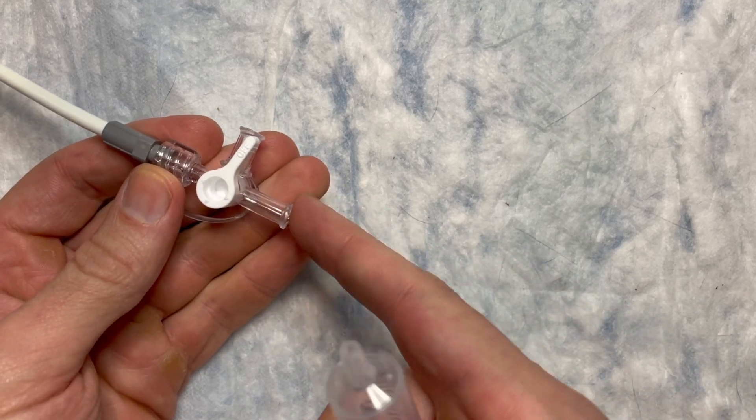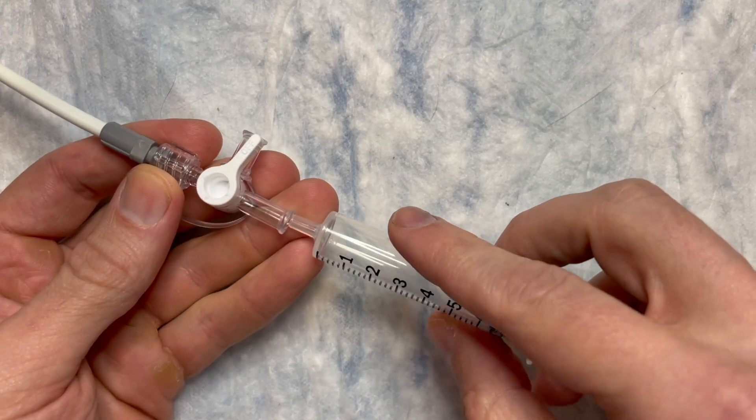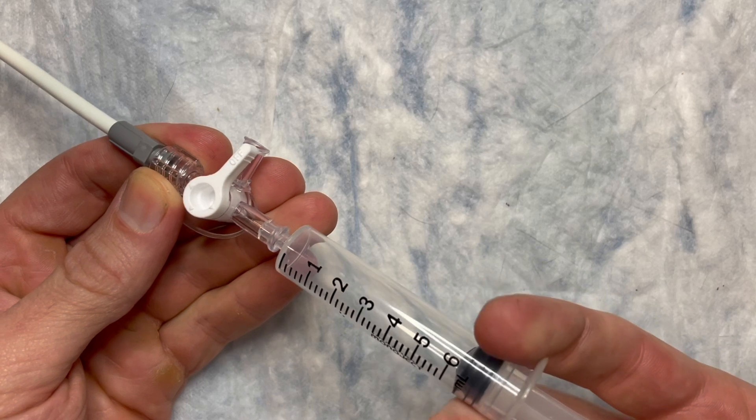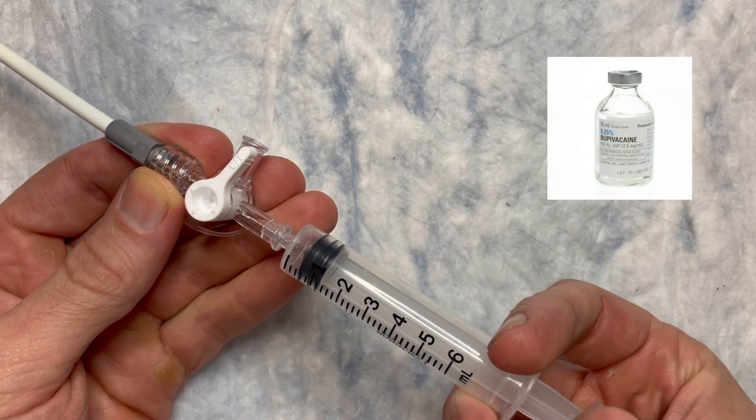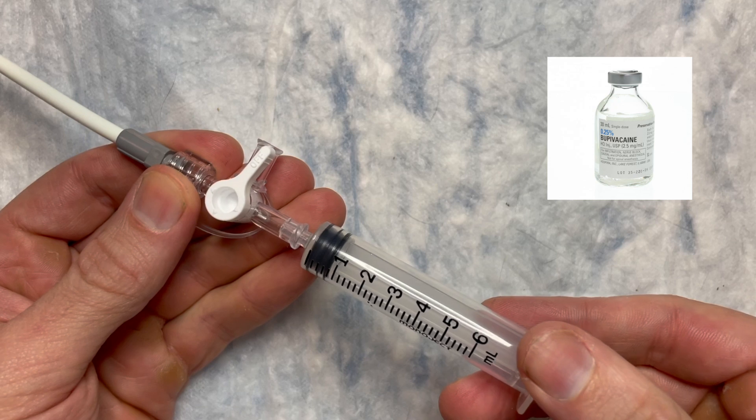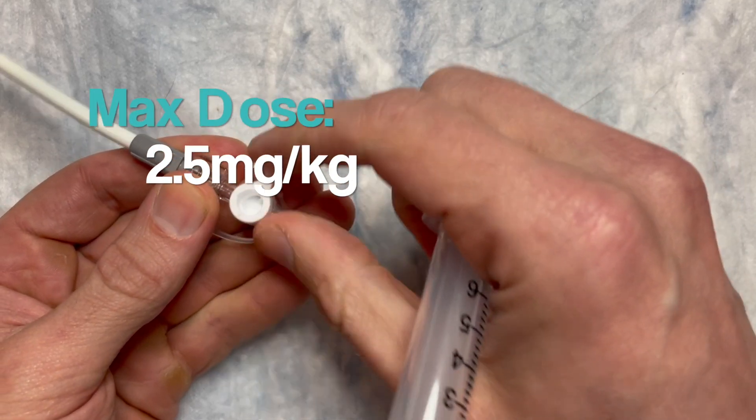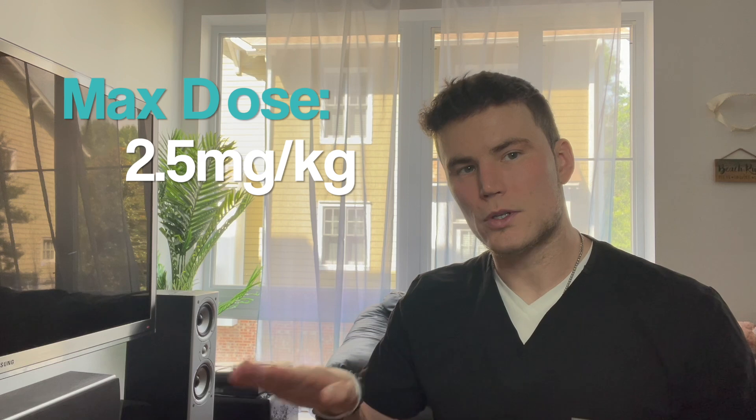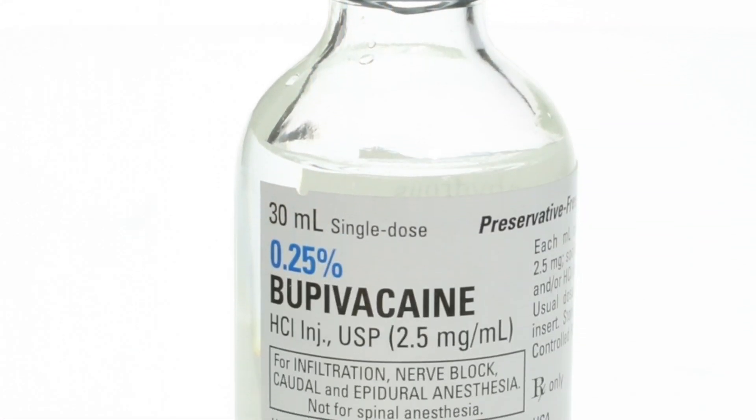First I wanted to touch on after you secure your pigtail catheter and you've got your attachment here, you can actually insert approximately 20 cc's of bupivacaine 0.25% into the pleural space through the pigtail to block some of those nerves and to decrease pain. We've all had pigtails that you insert and it just becomes very uncomfortable for the patient.